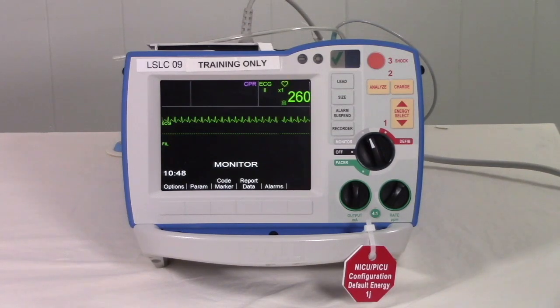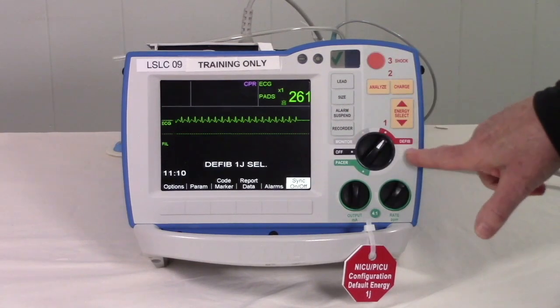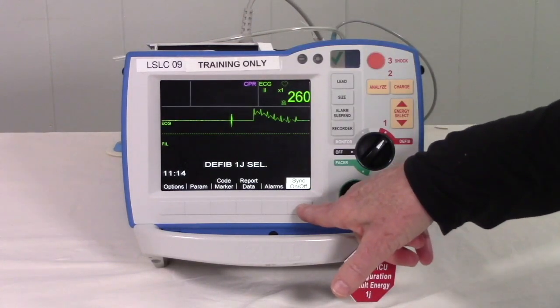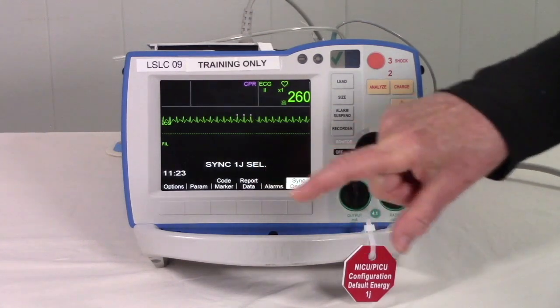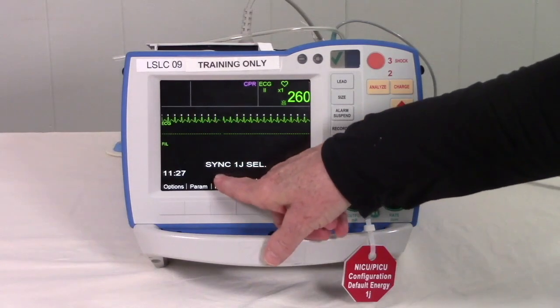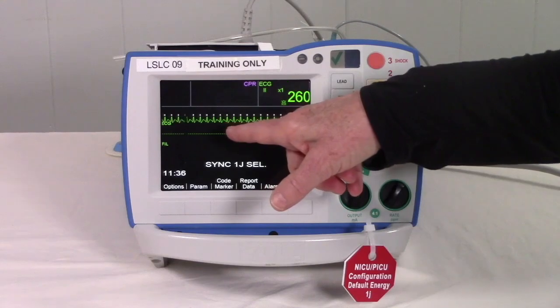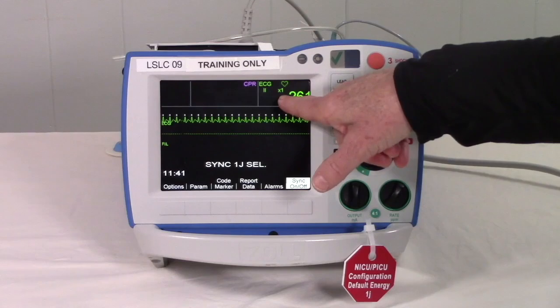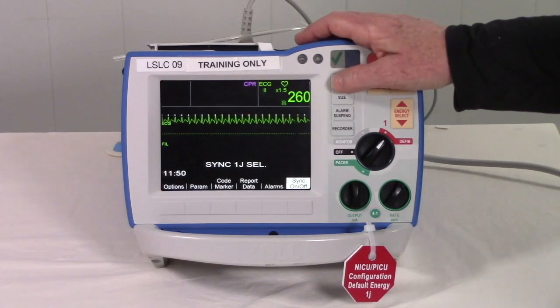Now let's cover synchronized cardioversion in the neonatal ICU. You might use it for SVT or ventricular tachycardia with a pulse. To use sync mode, you have pads and leads on the patient. Notice that on the Zoll there is no indication of sync until you turn it to defib — when you do, the sync option becomes available. Press sync to activate sync mode. You will know you're in sync mode because it will say 'sync' and the waveform will be highlighted. You must make sure this is an R wave; you may need to change the size to confirm.